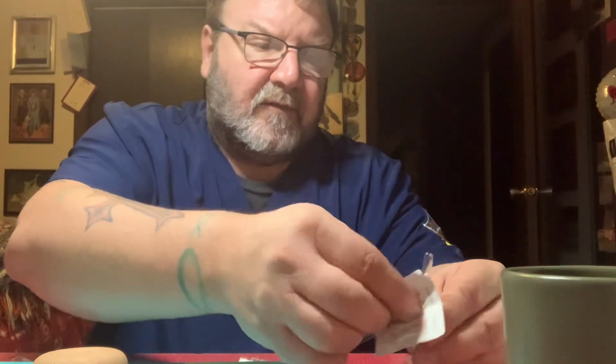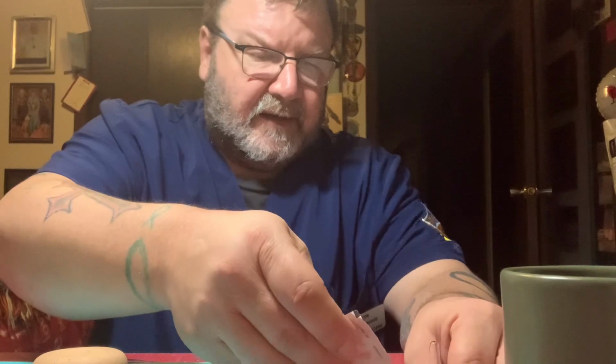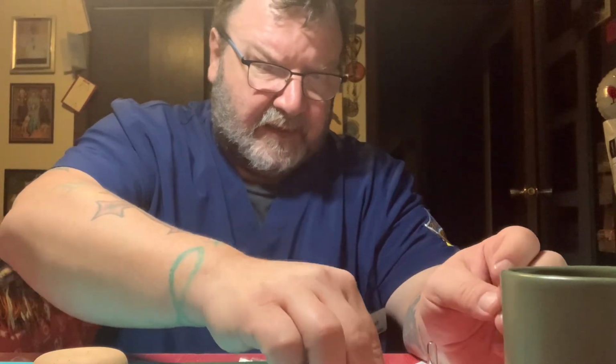So right now, what I'm going to do is prepare this medication. I'll do some hand hygiene. I've got my 2 checks. I can do my 3rd check at the bedside. I'm going to take an antimicrobial swab, and I'm going to go over my vial, and then I'll use the package to open it.